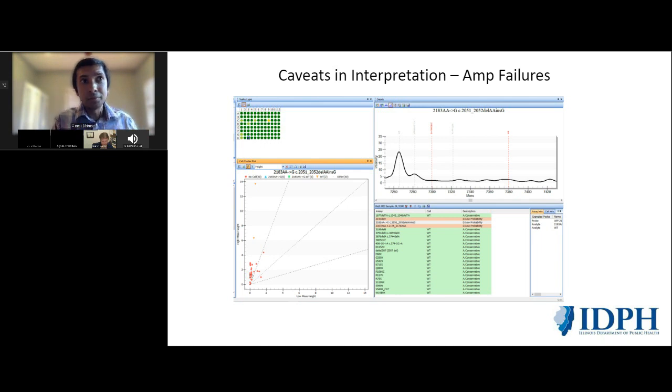So there are periods of time where it doesn't happen at all. And as with all science, sometimes it'll just magically happen, and for whatever reason, you can't figure out why. And no matter what you do, it's like, why is it not going away? Usually what we'll end up doing is that we'll try to replace all the reagents fresh. We will try to clean everything with a DNA off type of reagent. And more often than not, that will fix a lot of these amplification failures.